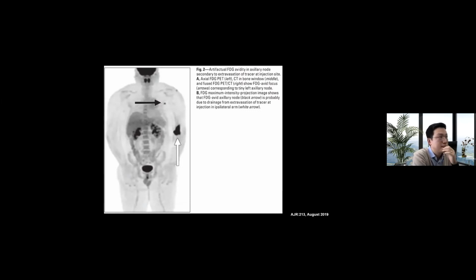I explained the AJCC staging system, both anatomic and prognostic, and explained the advantages, like the confirmed utility of FDG PET/CT scan in breast cancer imaging. And then one other potential area of using FDG PET/CT scan in breast cancer is prognostic evaluation, since breast cancer is adopting a prognostic stage.